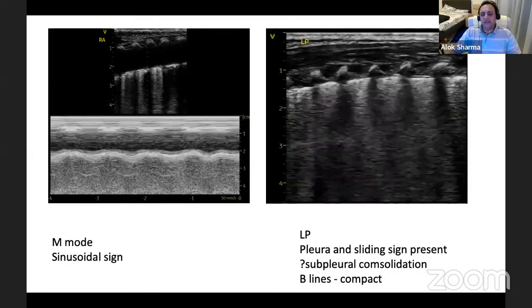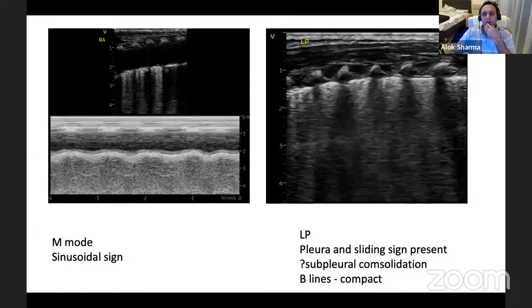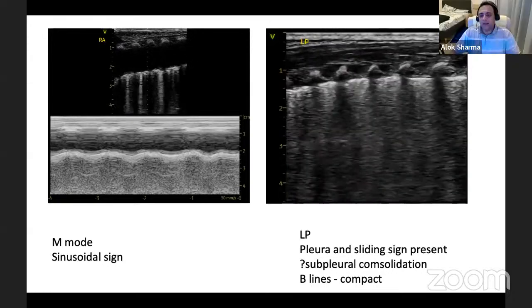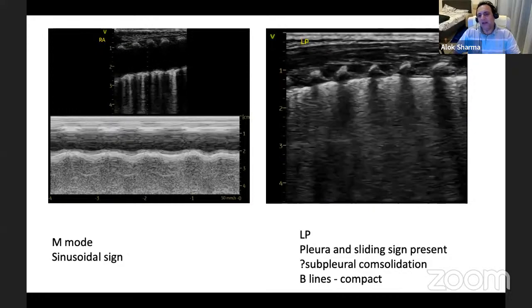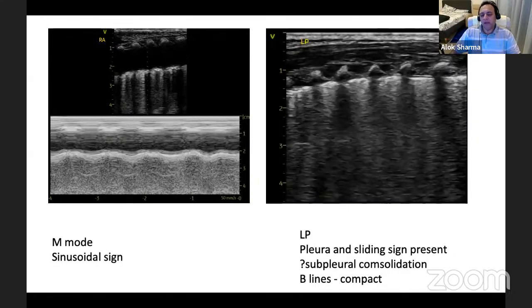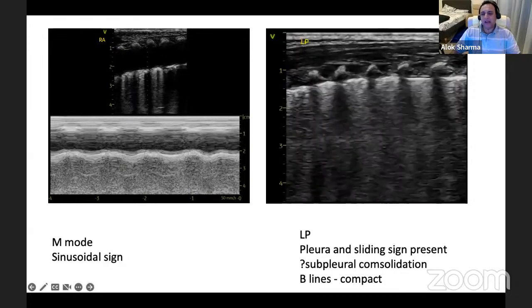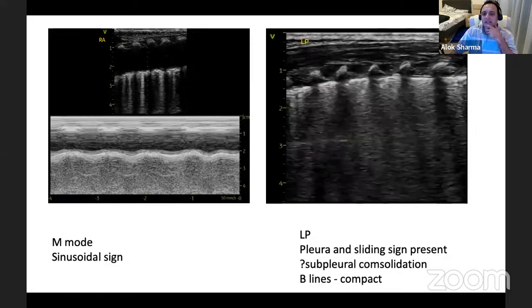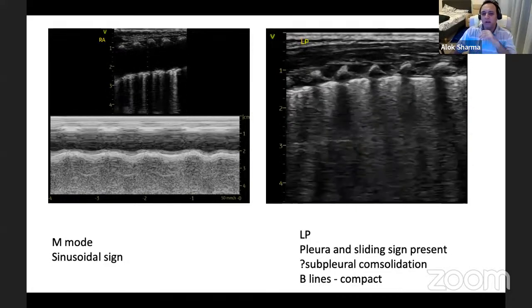And the reason I say this is crucial: if somebody comes and tells me this is a 24-weeker, I immediately start thinking elsewhere. But now you said this is a term baby with no respiratory distress. Hence my thinking that if I used a higher frequency probe, my gut feeling is what you just get is interstitial fluid there, which is probably likely to reflect fluid in the interlobular and intralobular spaces, as opposed to these being subpleural consolidations, which would go more with RDS.